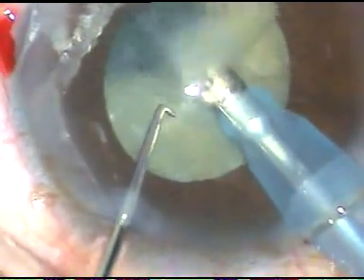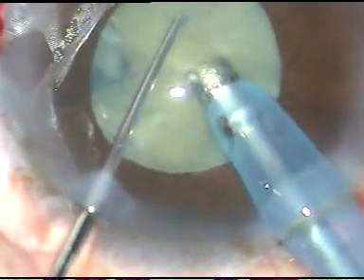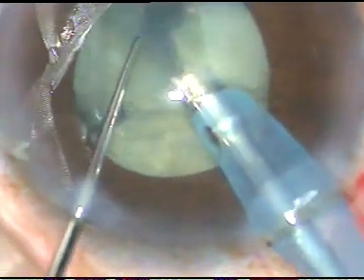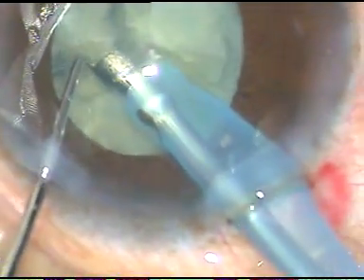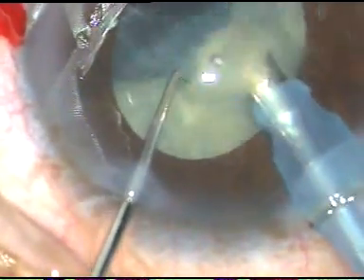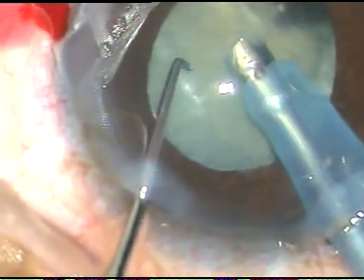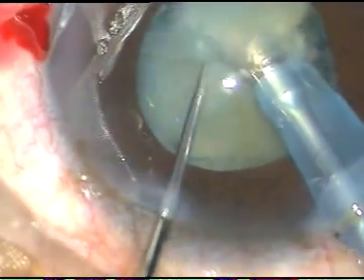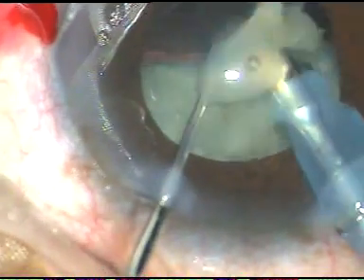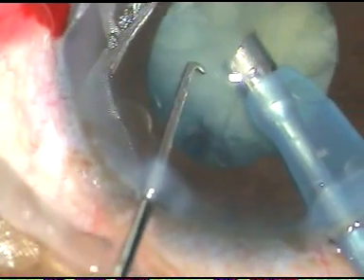I am cautious not to give undue stress on the zonule. Here it is, this another chop, another fragment is emulsified and removed. The phaco power in this case is 60%, flow rate is 40 ml per minute, and vacuum is 350 millimeter of mercury.